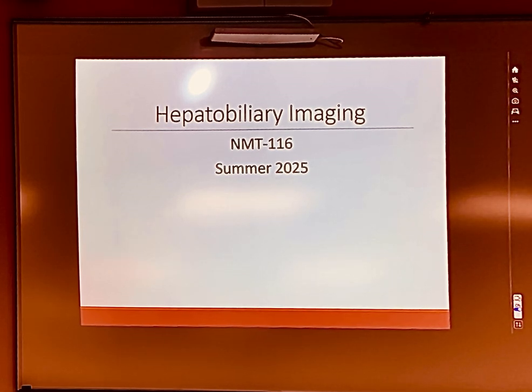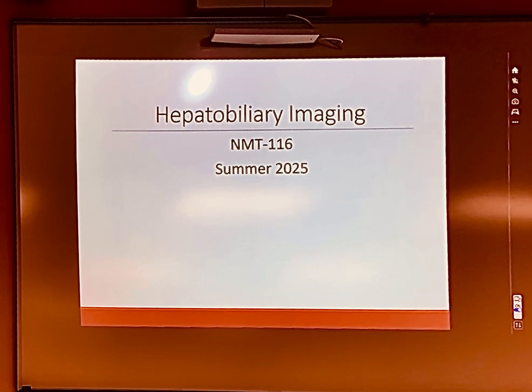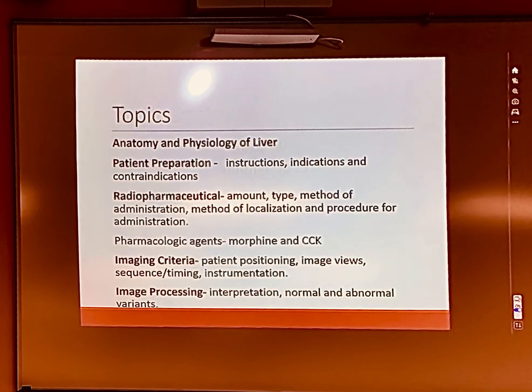So it's going to be cleared from the different lobes of the liver through the intrahepatic ducts, brought down through the hepatic duct, into the cystic duct, into the gallbladder, and then when the gallbladder is full, the gallbladder will release it back out through the cystic duct, and out into the common bile duct, and then out into the intestine. So those things you're going to see on a HIDA scan, or hepatobiliary imaging, right? Liver first, biliary duct second, gallbladder third, intestinal activity. Okay, that's your normal progression of that.